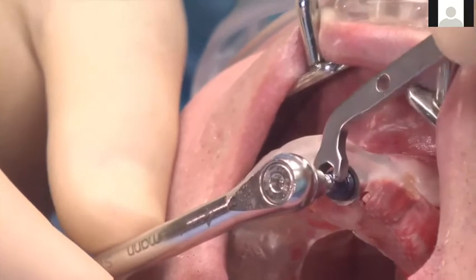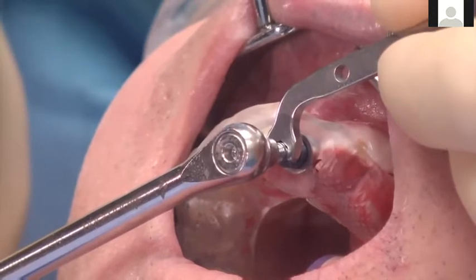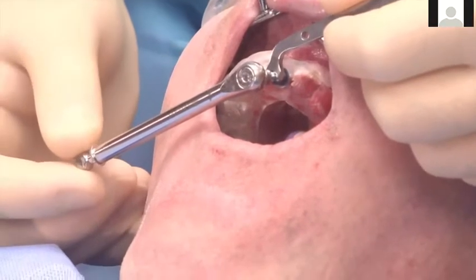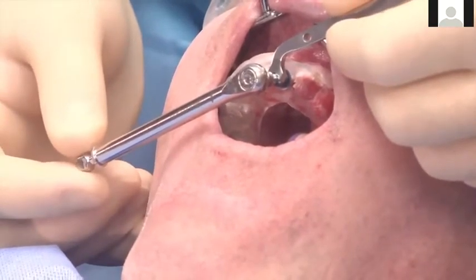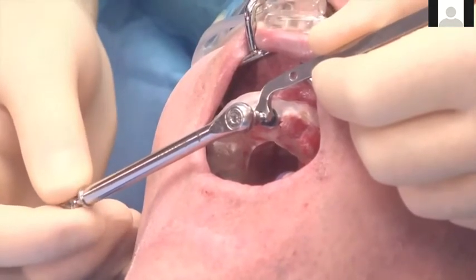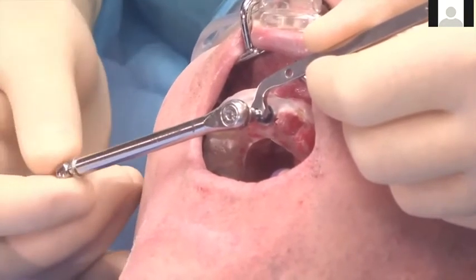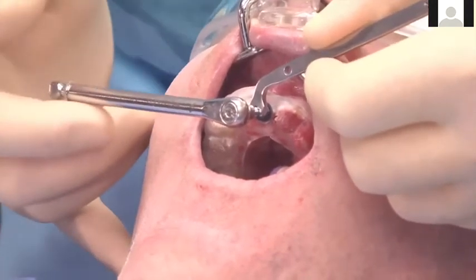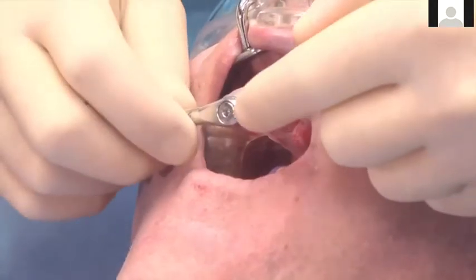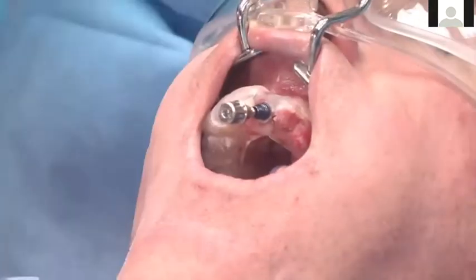Now the guided mount drivers, those lock-in mounts just pull out. The guided mount drivers, which we really are not going to use anymore, those have to be held in place with a key and then just unmounted by ratcheting them out in a counter direction. You don't have to do that anymore, because none of you will be really using those guided mount drivers anymore. Now we've got those guided drivers that you can order separately, or they come as part of the new guided kits, and then you can use the lock-in mounts that are then much easier to use. This is the old one where you just had to really pull this guided mount off.